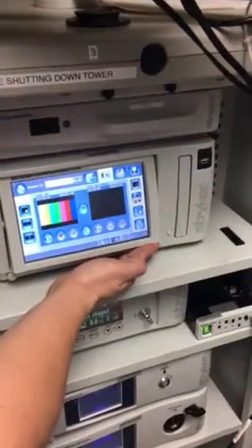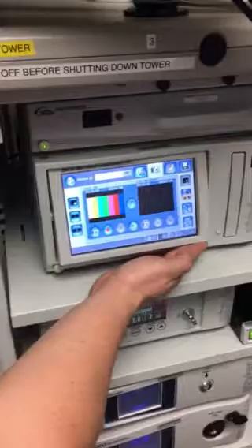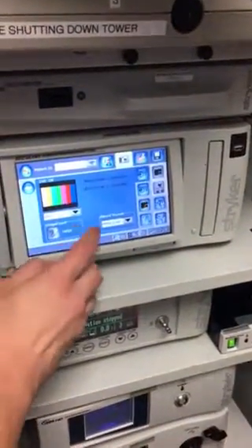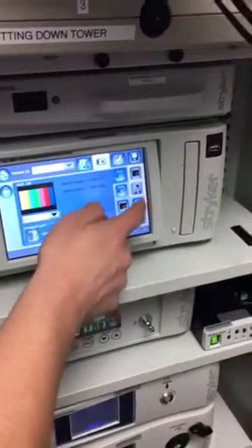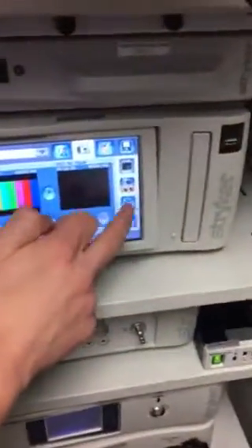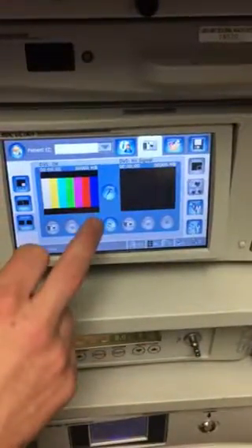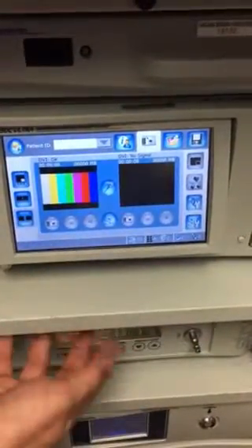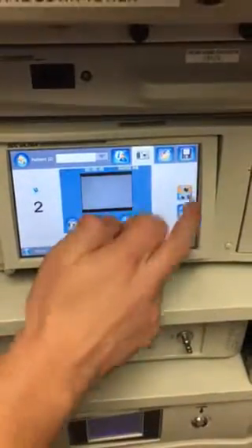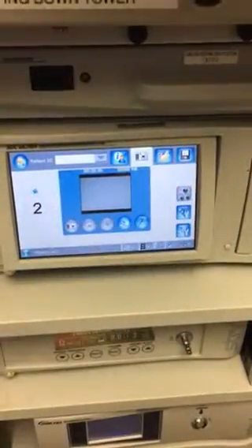We're setting up the ENT tower for microscope usage. First, make sure this is on the two-screen setting — there are two screens. You really want to end on two, so that's the button you would push.